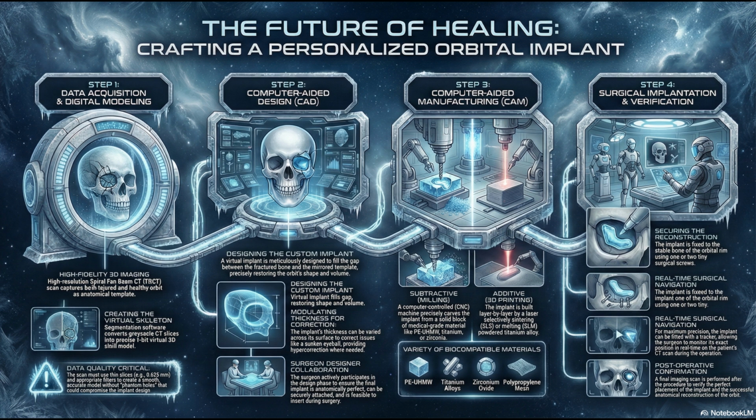Okay, I will absolutely concede that garbage data in means garbage implant out. The entire process is a non-starter without a good scan. But, and this is the core of my argument, the real intellectual heavy lifting, the place where the most sophisticated problem solving happens, is in the manipulation of that data and managing the clinical trade-offs that follow, the CAD phase. It's not just mapping a surface. It's an active design of conceptual correction.